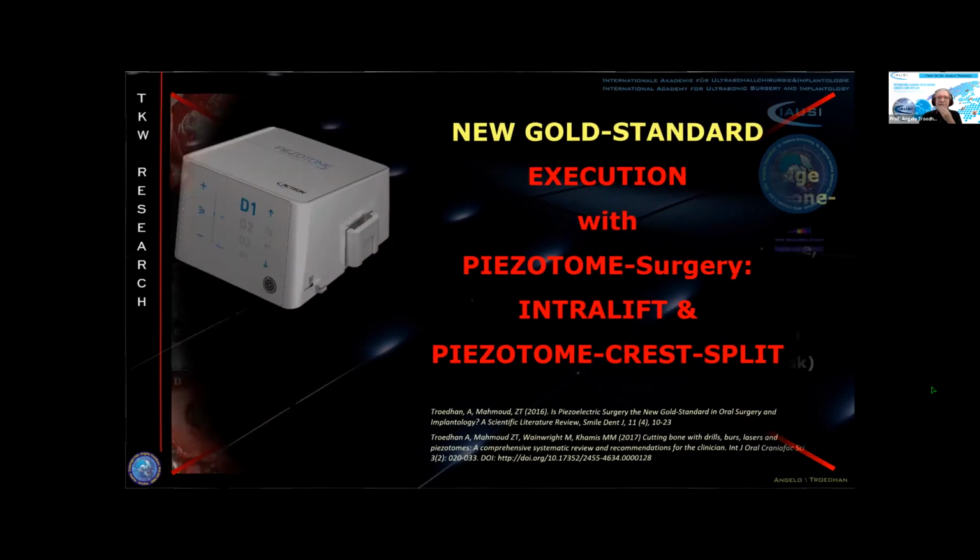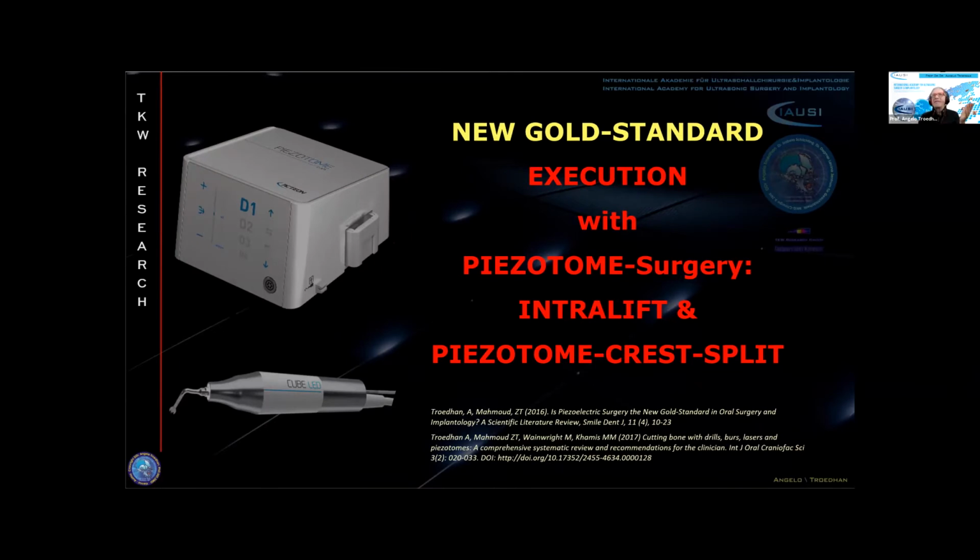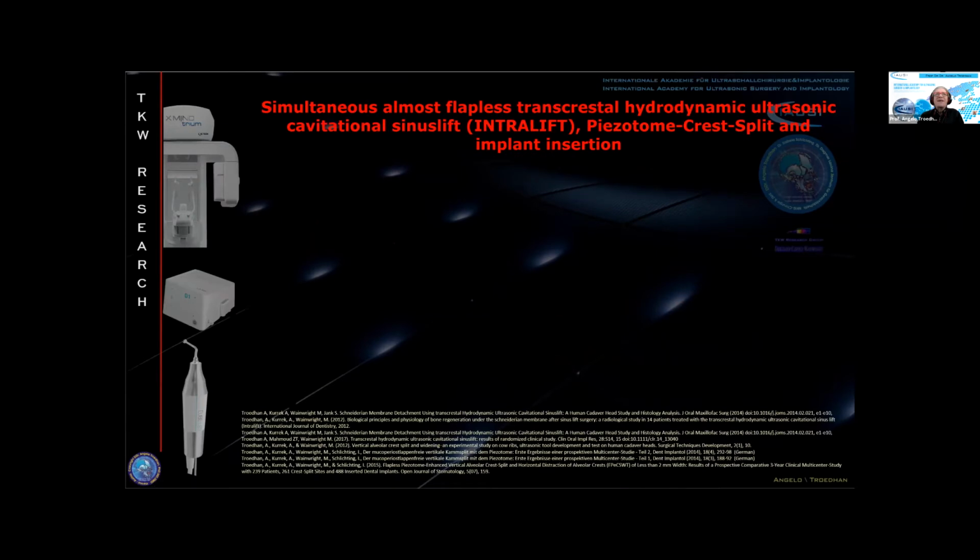What is the alternative? It's the new gold standard, the execution with piezotome surgery. In this case, we use two methods that my research team, Professor Marcel Wainwright, Professor Andreas Kurek, and I developed already back in 2006 and 2009. It's the INTRALIFT procedure and the Piezotome Crest Split. Down here, you will always find some references where we published this. So what is the simultaneous, almost flapless transcrestal hydrodynamic ultrasonic cavitational sinus lift, INTRALIFT?